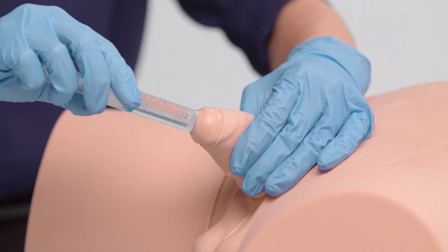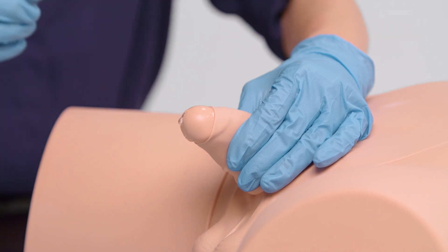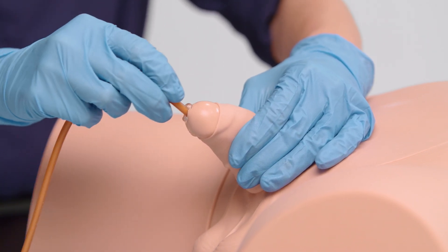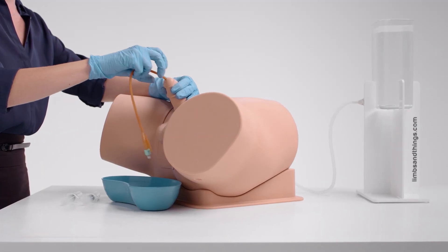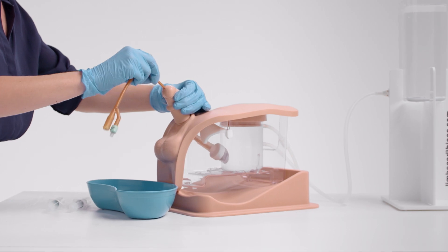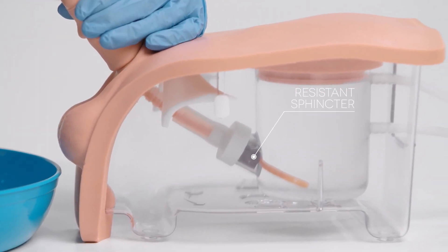The improved softness and more compliant genitalia enhance the realistic experience of catheter insertion. The ability to view the catheter path gives trainees and teachers real-time feedback on the location and progress of the procedure.